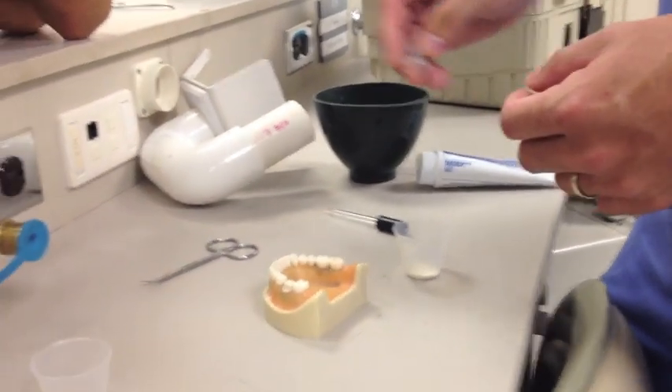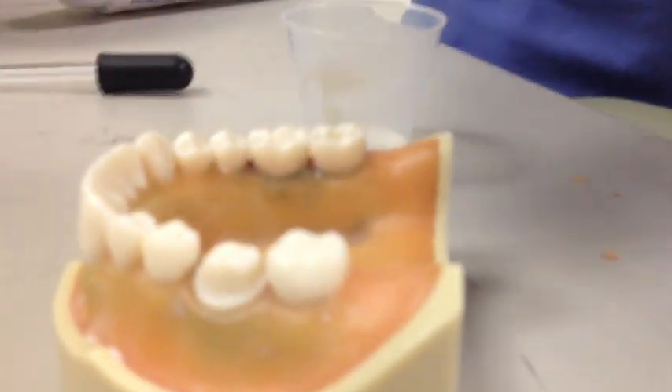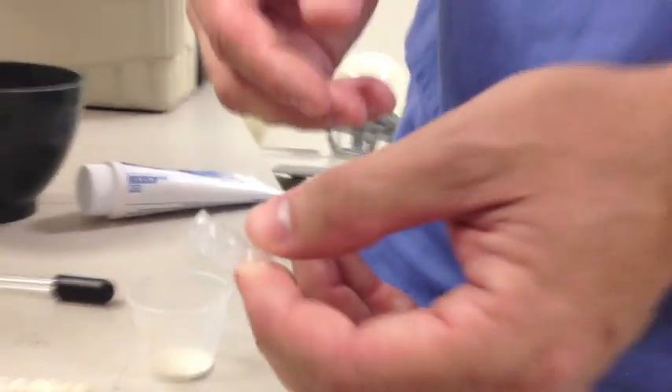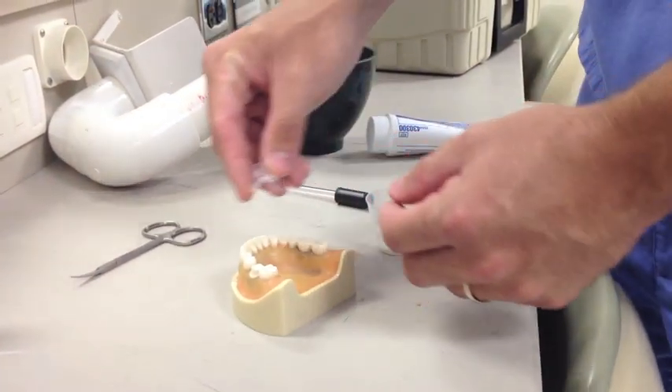Today we're going to be provisionalizing our previously prepped number 19. We're going to be using acrylic, and for supplies we have our previously made stent — we just use a suck-down method for this. You really need to know how to make a stent because if you don't, this video is kind of out of your league.